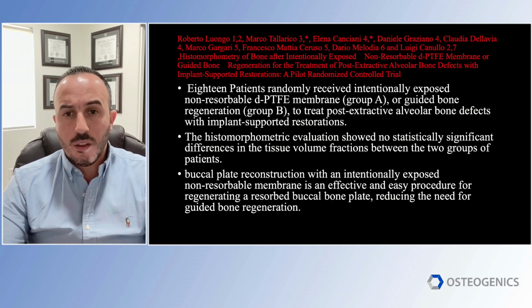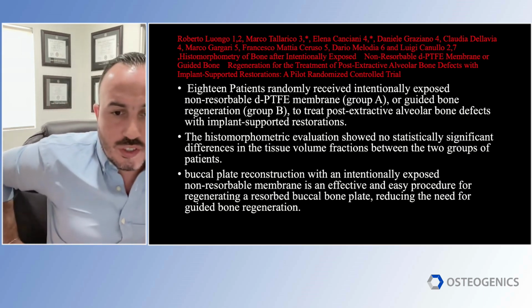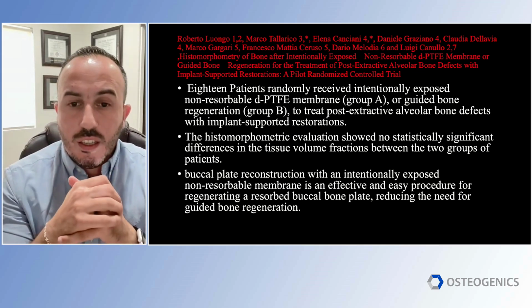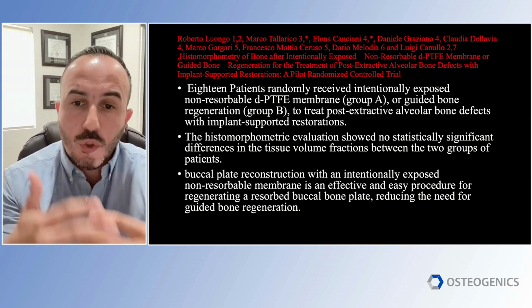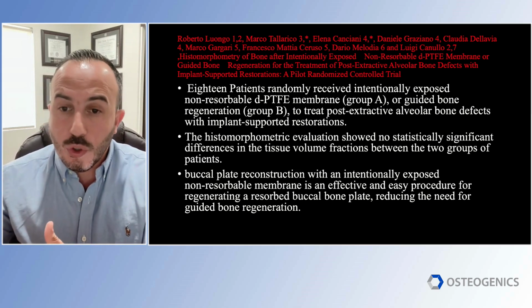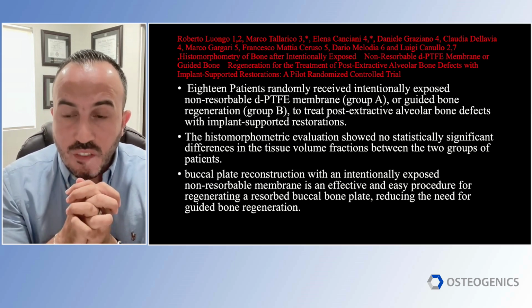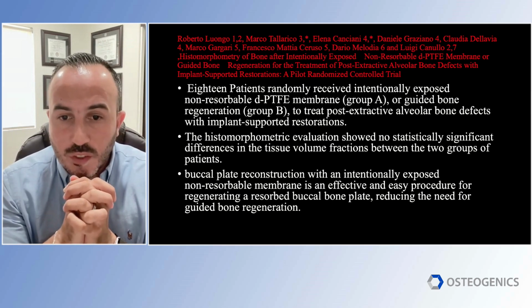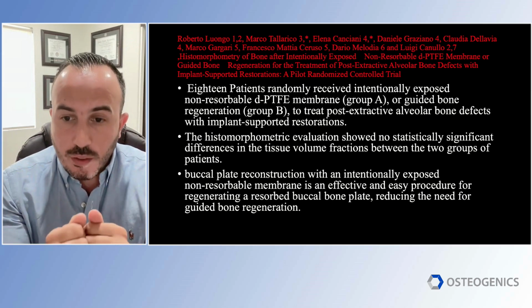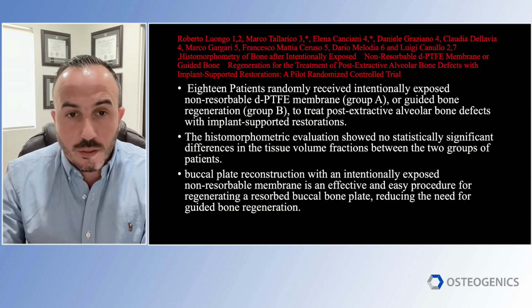Another study I love, because when you have a buccal bone wall deficiency and it's blown out, they compared the dense PTFE in an open healing concept against doing a GBR like we're used to doing. Would we get similar results? The histomorphometric evaluation showed no significant difference between both techniques, and both were effective in getting back the buccal plate and being able to place the implant with no issues.